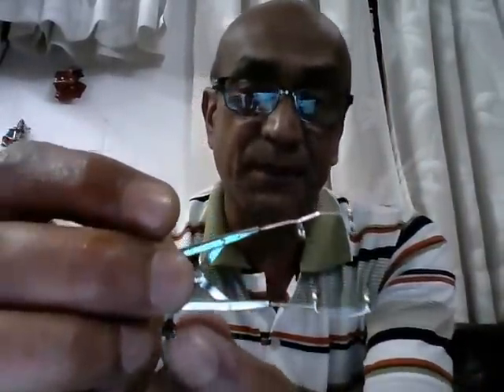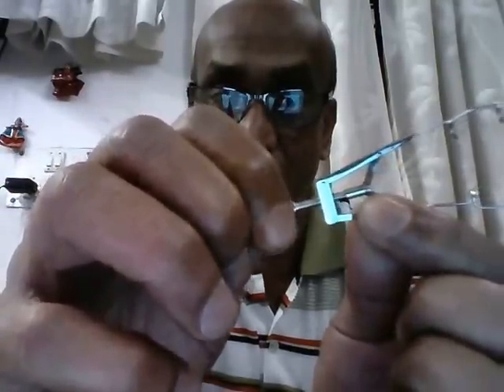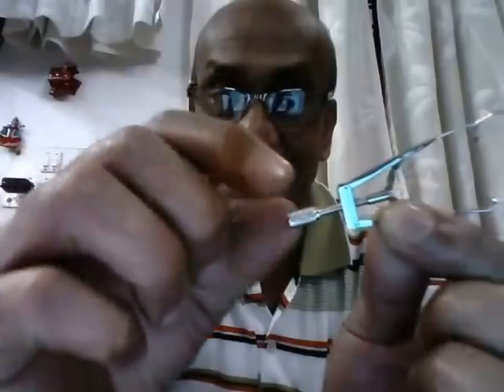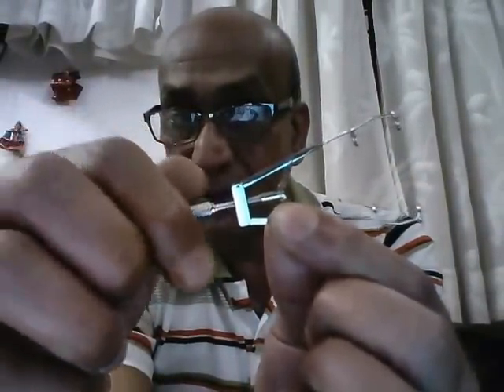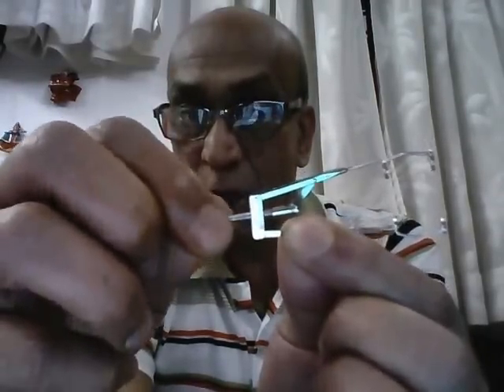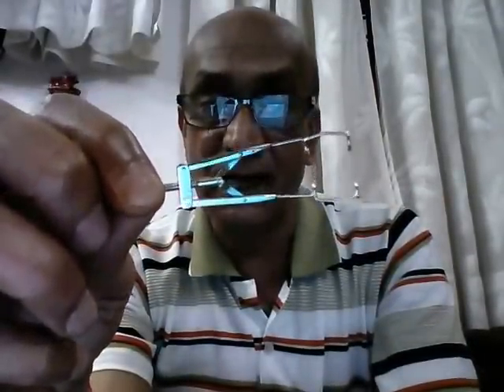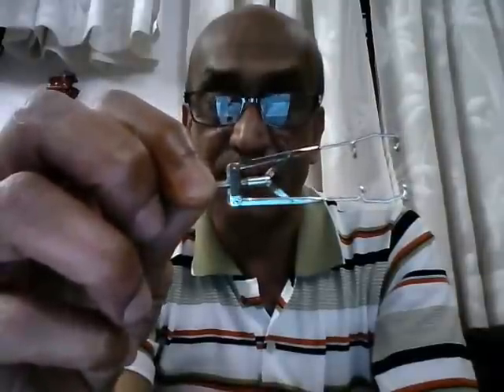Another interesting aspect: normally when you turn a screw clockwise you close the instrument, but in this eye speculum, turning the screw clockwise opens it and turning it anti-clockwise closes it. This is the universal eye speculum used to separate the two eyelids during ophthalmic surgery.